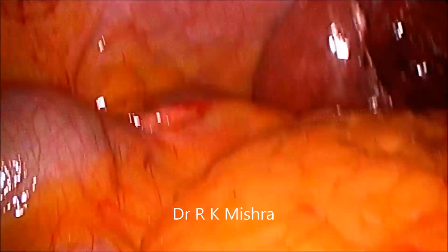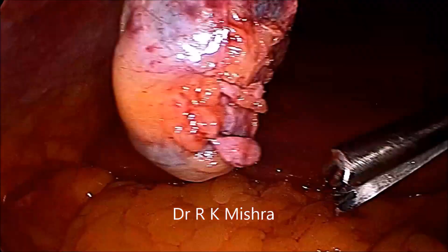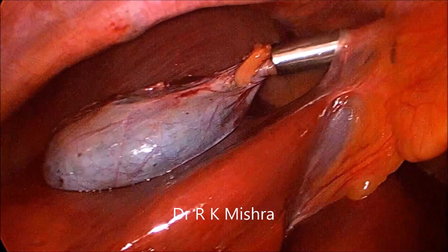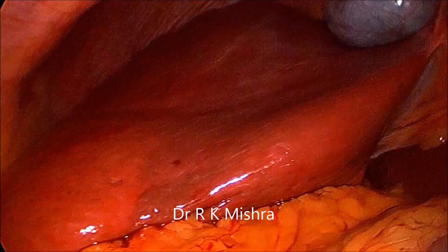This is the last pedicle. Just turn the light cable up to have a look below to see any active bleeding. Little oozing is okay, and then it is separated. Bring one claw forcep, hold it at the place where you applied the clip, bring the neck of the gallbladder into the cannula, and then bring everything together. You can put a suction to suck the bile or use an ovum forcep to extract the stone.